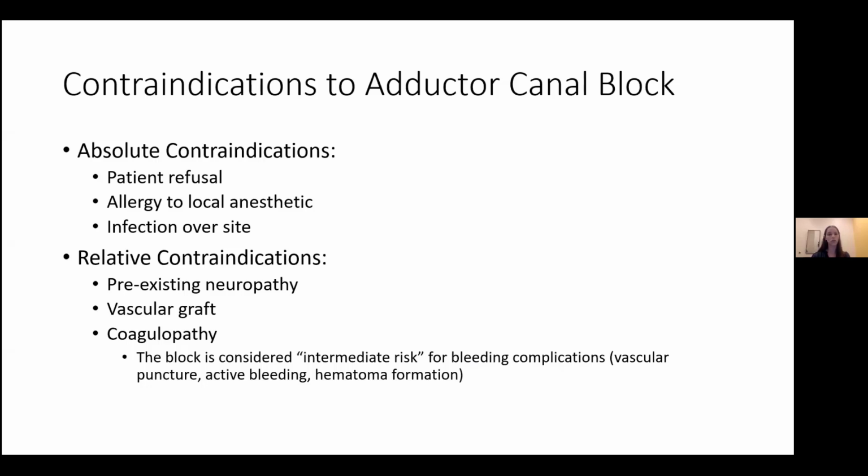And so there's one artery that is pulsatile and one artery that is very much not pulsatile. So it can be just very difficult to find the correct spot, and then risk of graft puncture, where it would not be able to heal itself and potentially cause a hematoma, is something you have to be aware of.